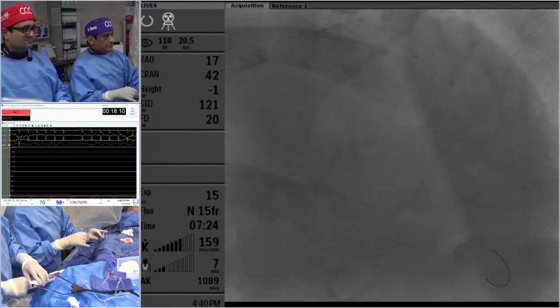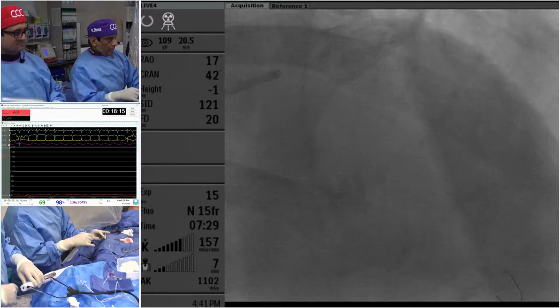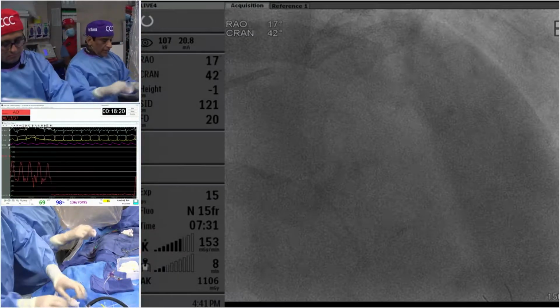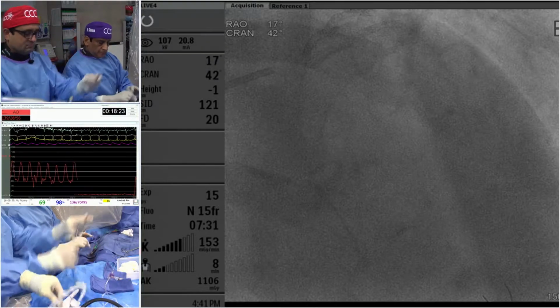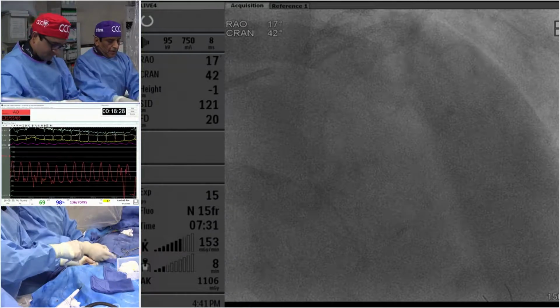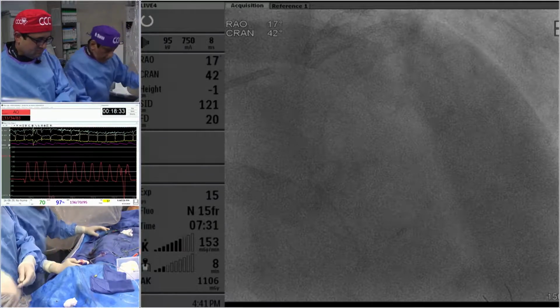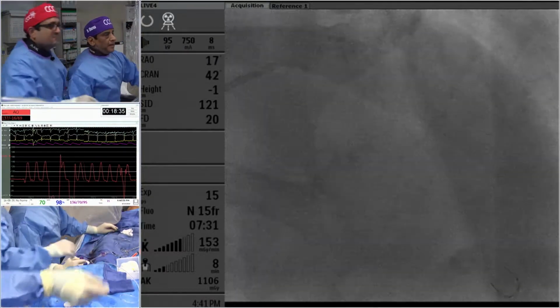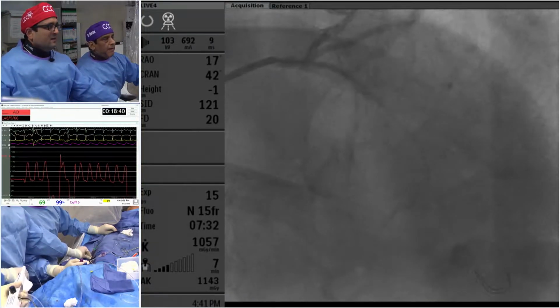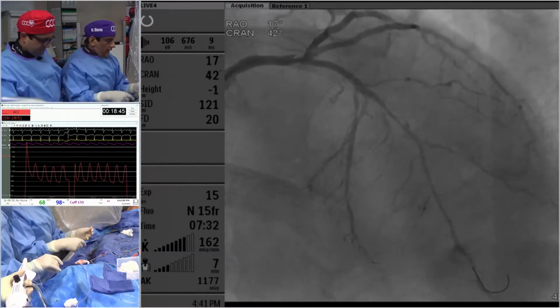The resistance of the lesion was not that bad, huh, Sharma? Yes. The apical, the distal resistance, that's where things get thin, when the rota doesn't want to go, and then you think about the extra support. But in this case, it looked like a soft lesion, huh? Yes, it was kind of a softer lesion, and the mid LAD didn't give any trouble. It was the distal LAD which gave us a little trouble, but we were able to go through it. And now see here. Good. So we'll put a wire side by side and dilate with the balloon.